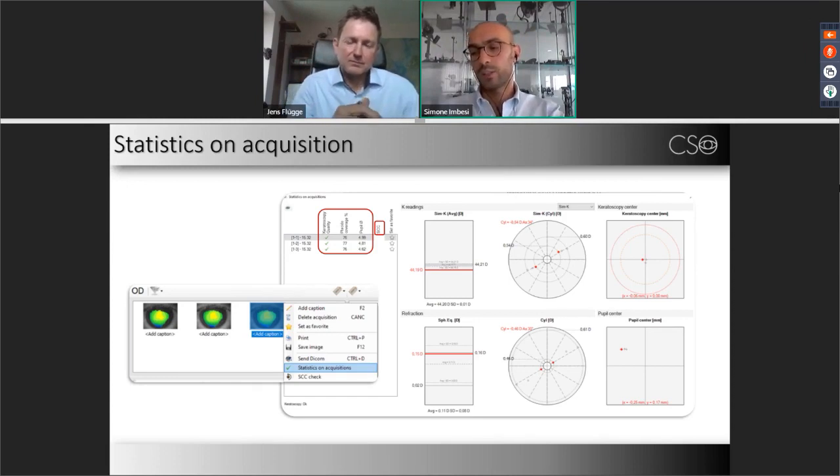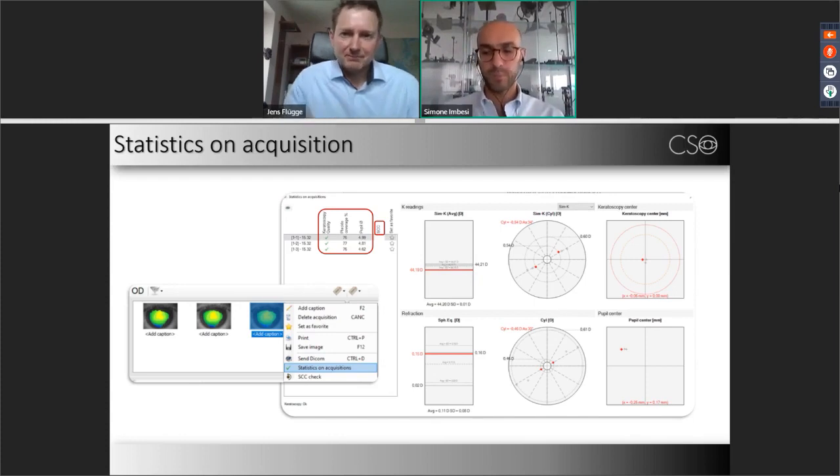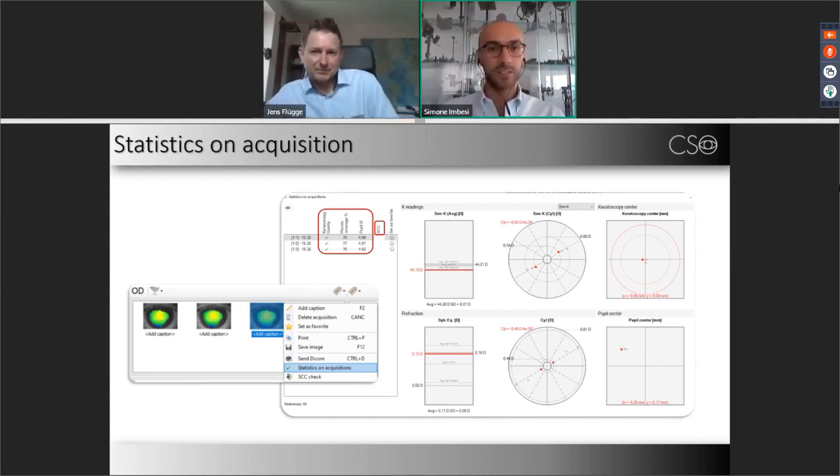And thanks to this, SCHWIND can manage the correct orientation of the treatment. To get this value better, it is suggested to cover the eye without touching it, because if you touch the eye, you can compromise the opening of the contralateral eye. So it is suggested to cover the eye and ask the patient to open wide. Okay, and you will get a good SCC value.